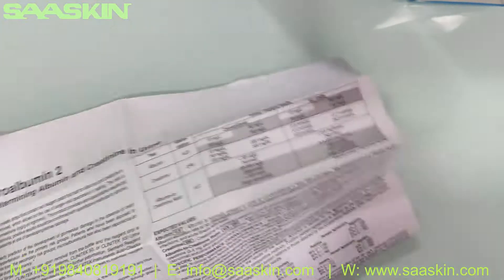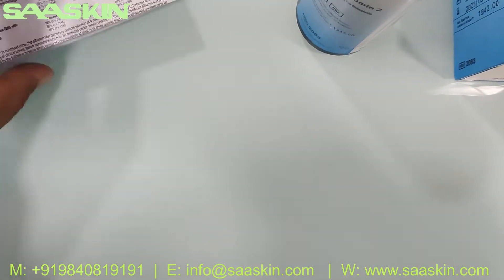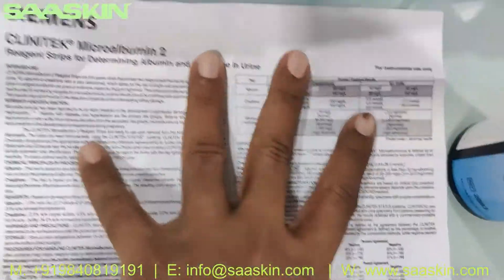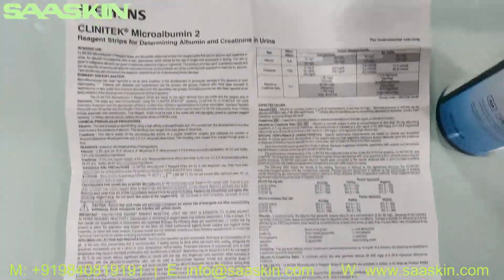You get the complete instruction manual for doing the test. The IFU brochure helps you understand the process of how to do the test and how to interpret the test results. You have all the complete details here.